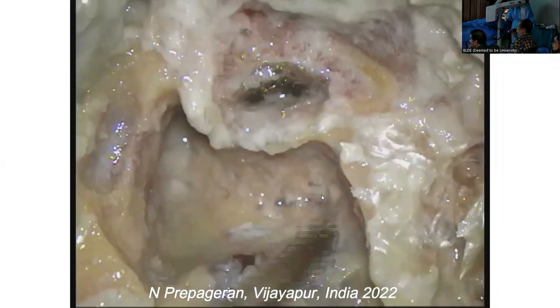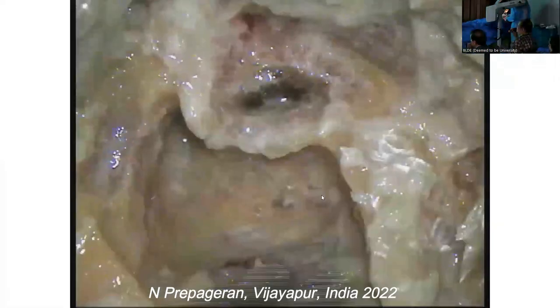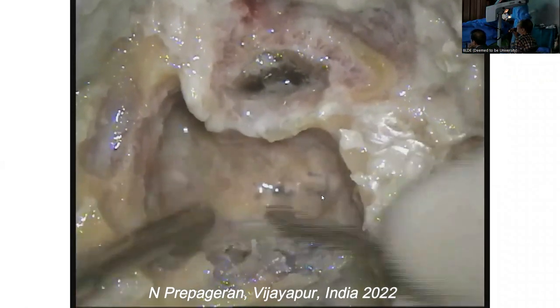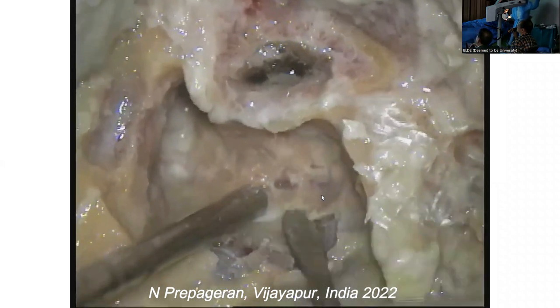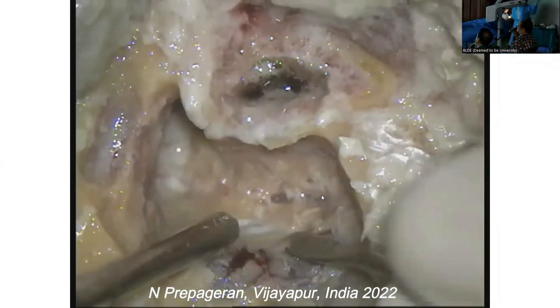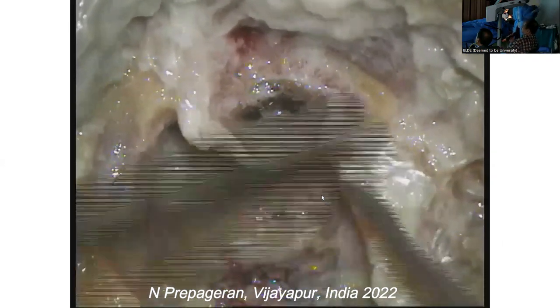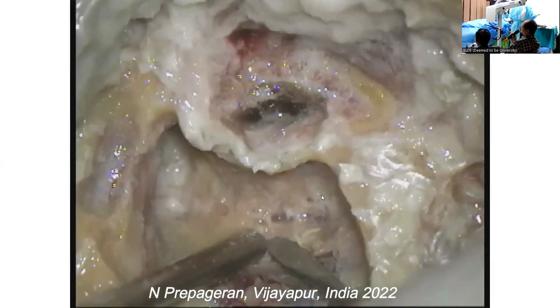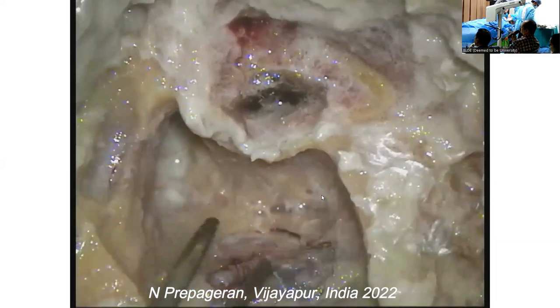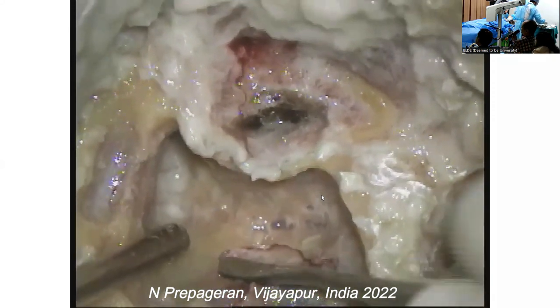Elevator. What I'm doing exactly is how I'll do it in real life. The only difference is by now I would have changed into a diamond burr. That's the pre-sigmoid. And being as lazy as I am, I will end up using a bone nibbler by now, and then I'm going to remove all this bone. Now we are going to come to pre-sigmoid. That's your endolymphatic sac. Can you see, guys? This triangle is the endolymphatic sac. Same way, I'm going to push all this down.